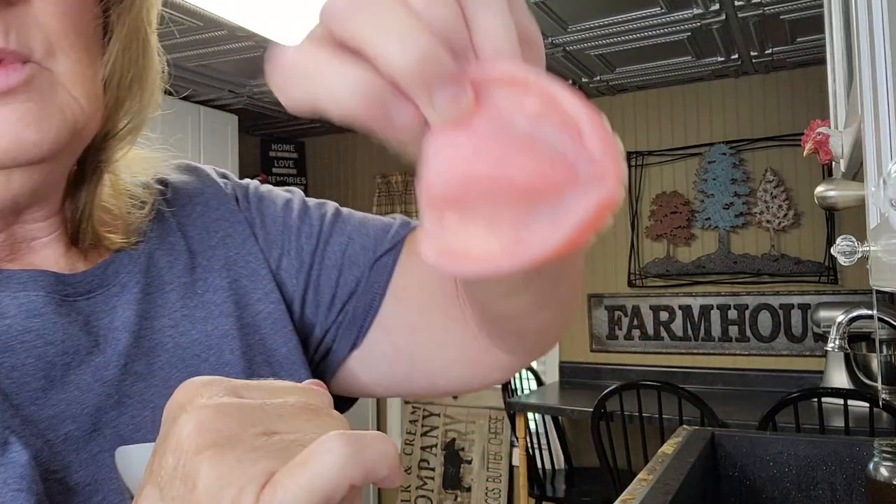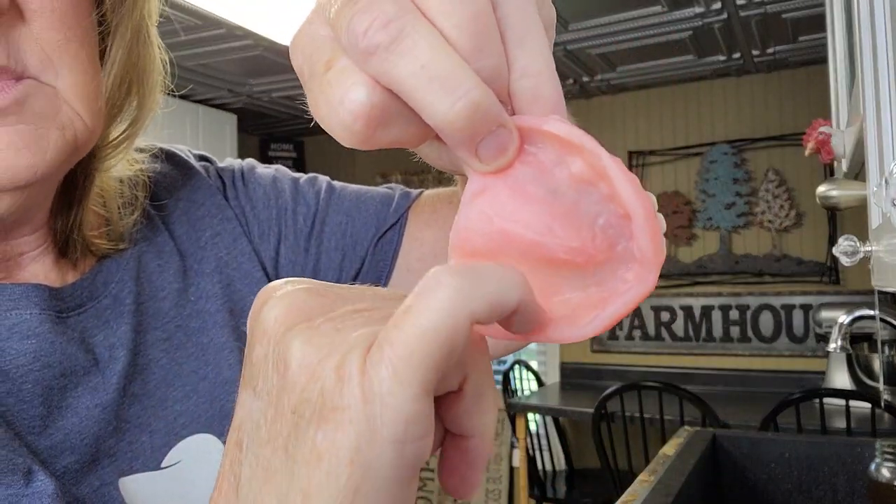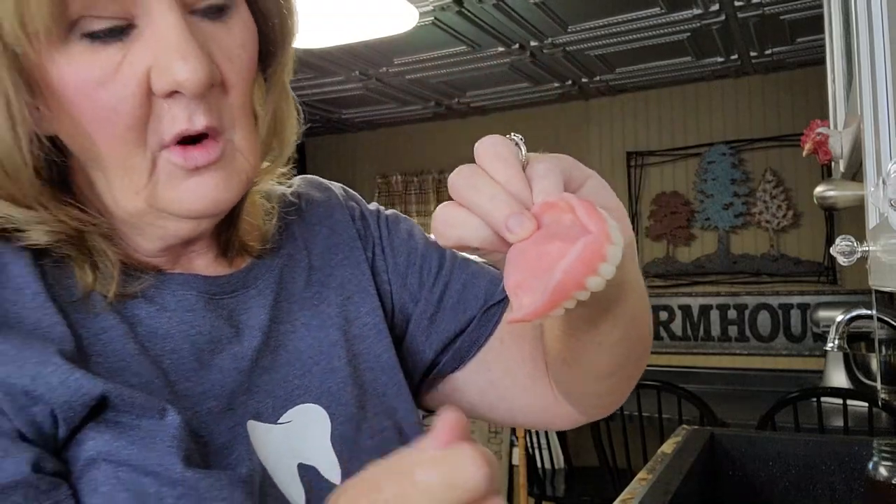My dentures — here they are, my top plate — they're hitting back here on my gum. There's always been something there. I don't know what it is, but it's hitting that thing and I can see where it's hitting right here on this edge. So I'm going to file that down just a tiny bit so it feels better.